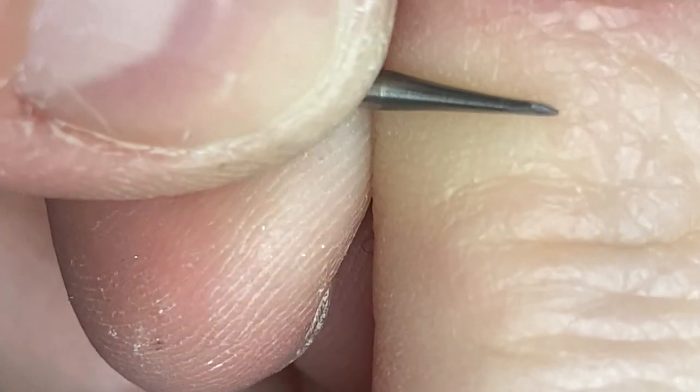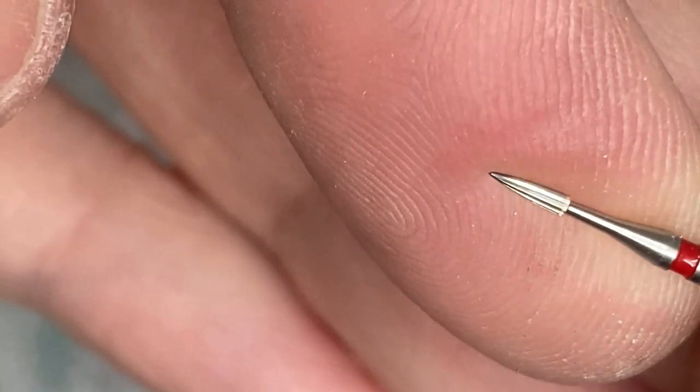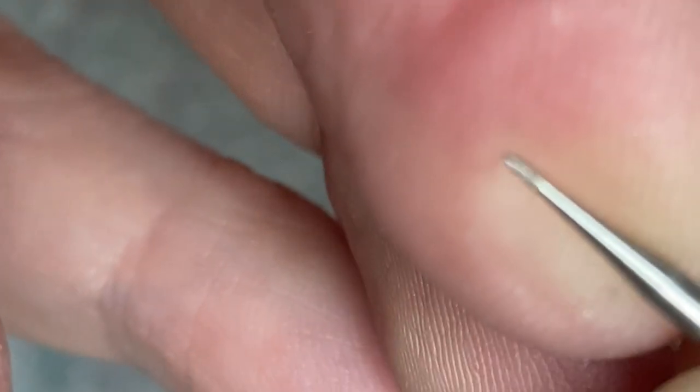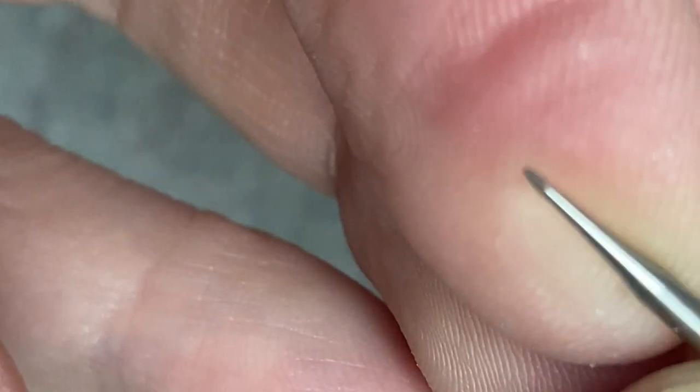Of course it doesn't have those little grooves like the commercial one, but it's okay — it will still do the job. Don't worry about the grooves, it will still do the job.